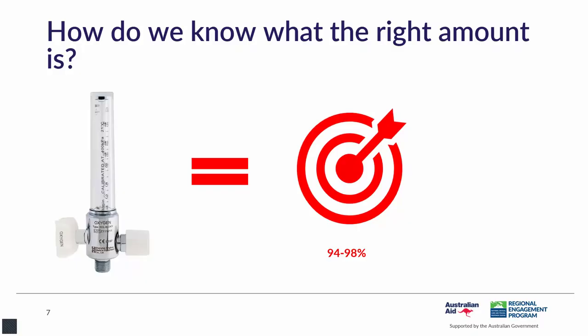I think sometimes we get a little bit scared to reduce oxygen levels, but in reality, if our patients are oxygenating well and have good saturations, there should be theoretically no reason why we can't begin to bring our oxygen flow meters down. I'm going to pause there.